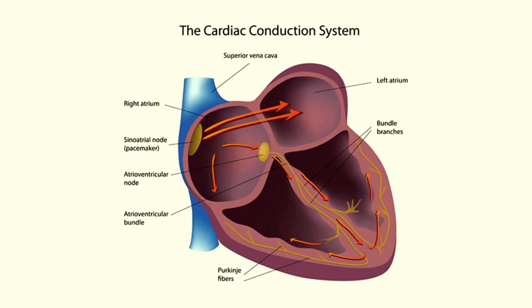Positive. And then lead AVR, which looks up and to the right, what's that going to do? It's going to be negative. Yeah, it's coming right at me. I'm looking that way. My positive end is that way. Sorry, I said that confusingly. But it's going to be negative in AVR.